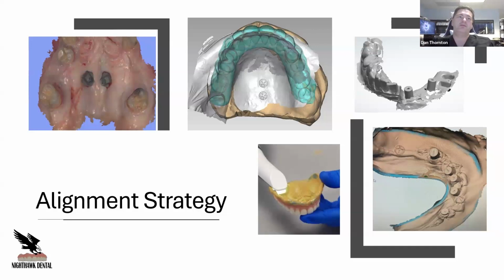You can also take an impression that normally has caps in it. So it's technically like a denture, but sometimes you can even make a bite tray that somewhat has teeth on it, which kind of helps you with the stop to do the impression. Most of the doctors I work with use the palatal markers, or they'll leave the back molars for me just for the alignment strategy. Then they remove those teeth or the markers after they're done with that final scan. They'll check before they actually take them out to make sure I get the good scan.